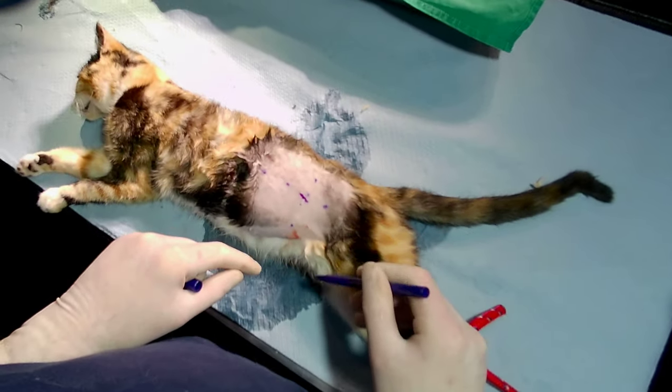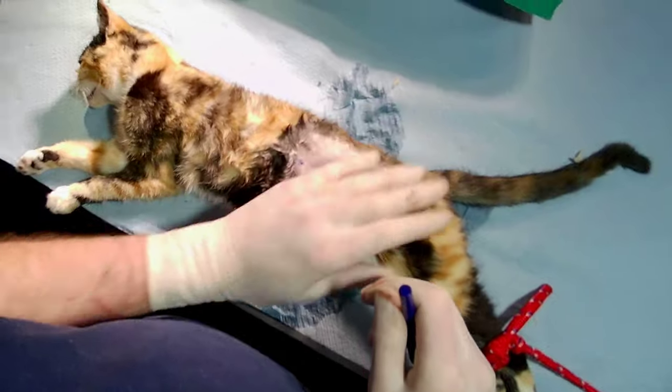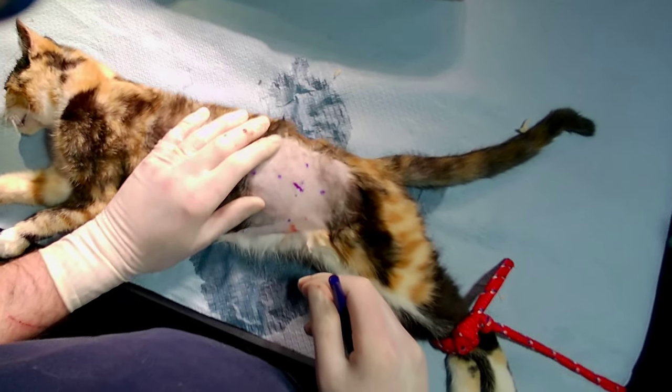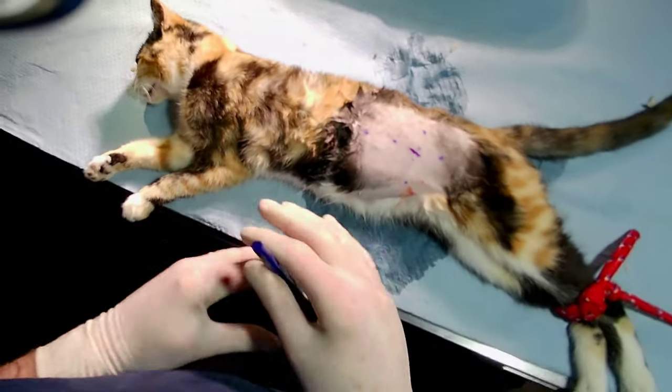The other thing to make sure of is that you don't move the skin while making the incision, because you'll move your marker off the intended site. Don't shift the skin around like this — hold it stable while you incise, otherwise your marker is going to go offline.